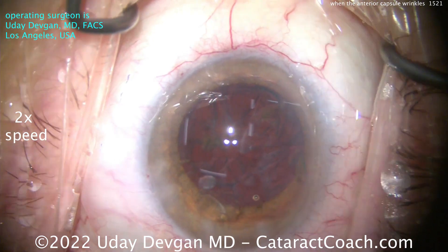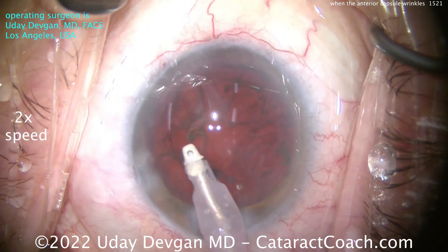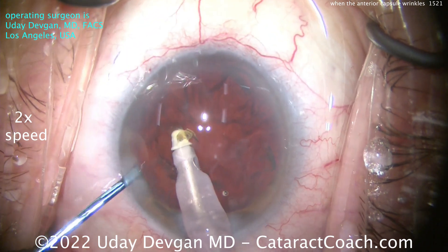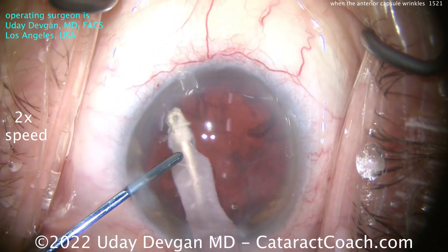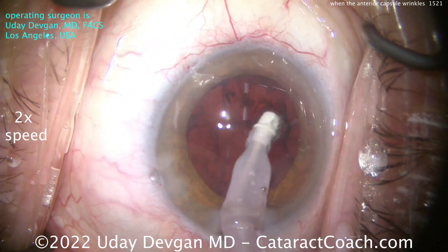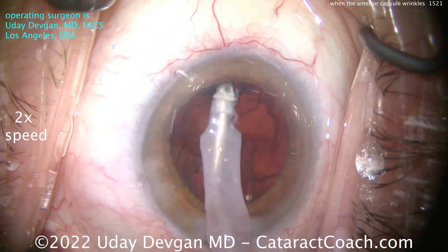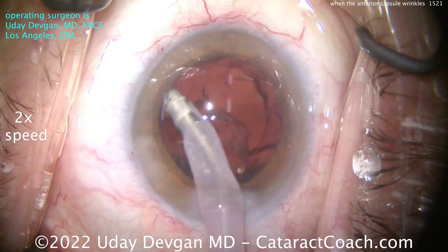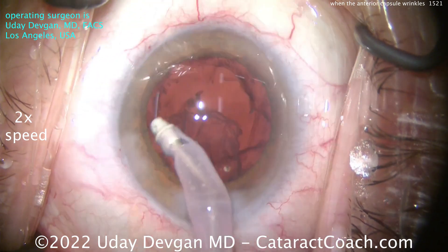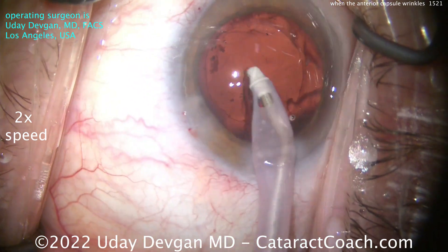The nucleus is out. Now let's get some cortex out with the IA probe. Here comes the IA probe — there's a little nuclear chunk blocking the tip; we'll push it in and make sure that doesn't block the tip. As I'm doing the cortex removal, I'm looking at the rhexis edge, making sure it is not moving. If the rhexis edge is moving, that means the zonular support is even worse than you thought — you're moving the whole capsular bag. I don't want that.